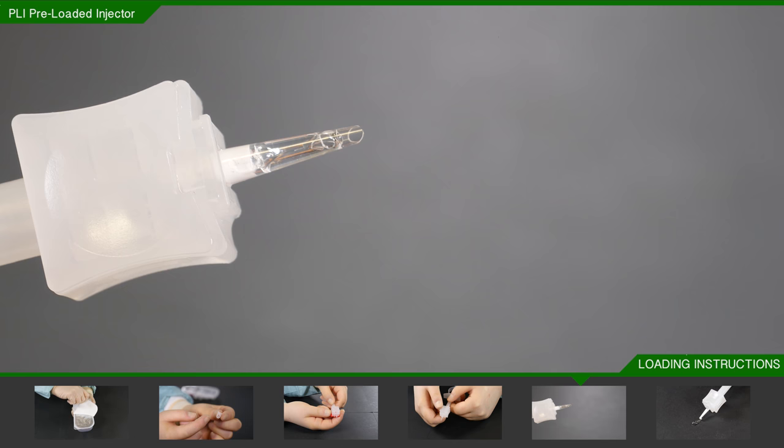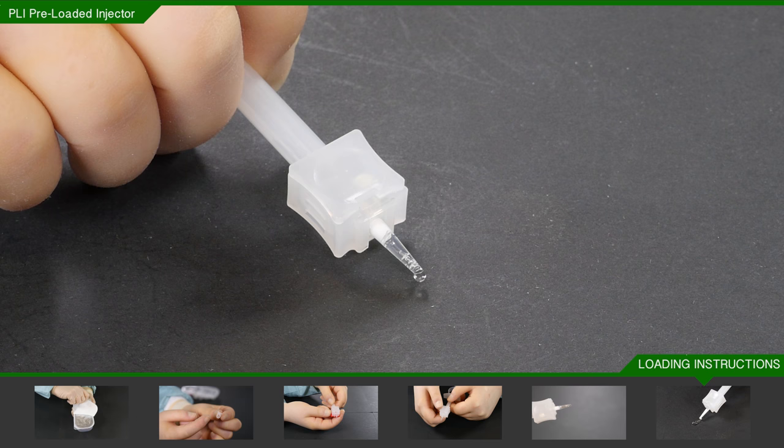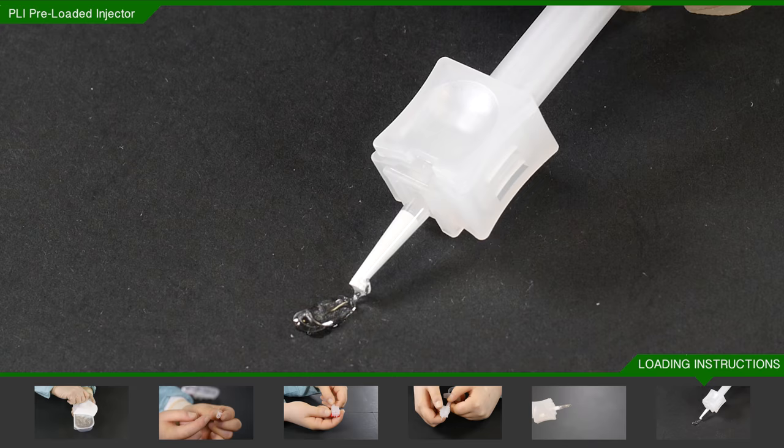If you are happy that the lens is correct, you are ready to inject. With this system, you can safely inject the lens into the eye in one smooth push of the plunger.